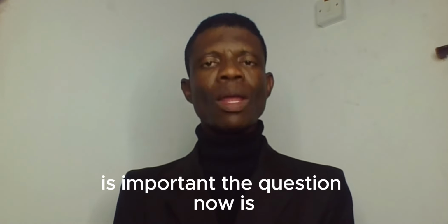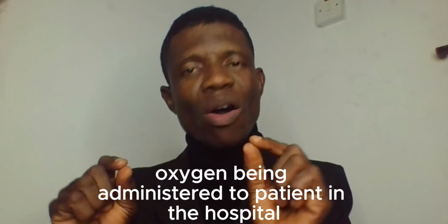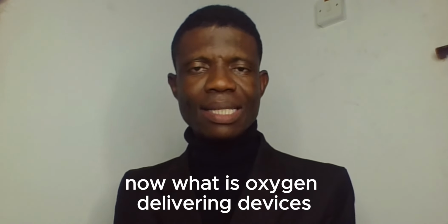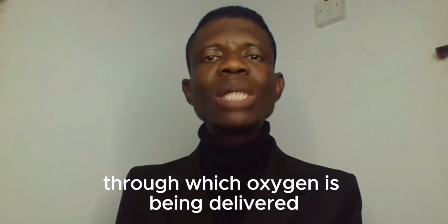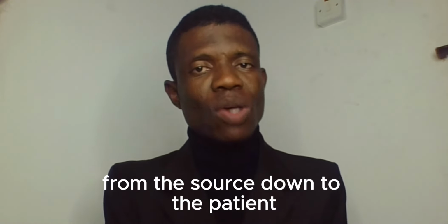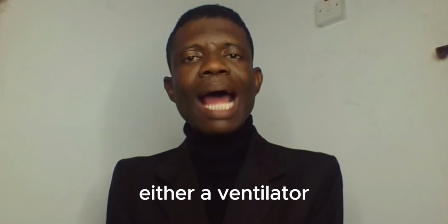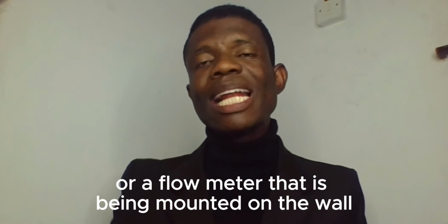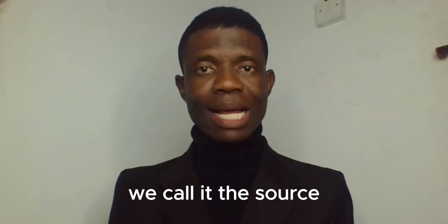It's important. But the question now is, how is this oxygen being administered to patients in the hospital? This is what we are going to be discussing as we go on with this lesson. Now, what are oxygen delivering devices? They are the medical devices that serve as a channel through which oxygen is delivered from the source down to the patient. Please don't forget that the source may be a ventilator, an anesthetic machine, or a flow meter mounted on the wall. So long as it can supply oxygen to the patient, we call it the source.